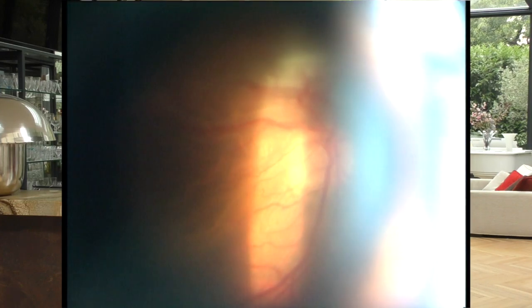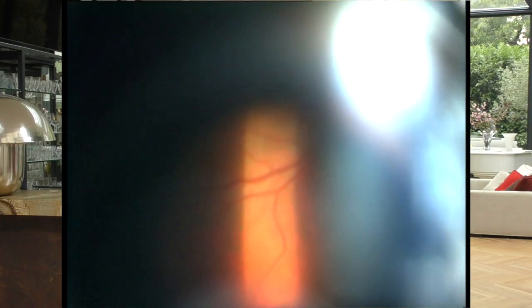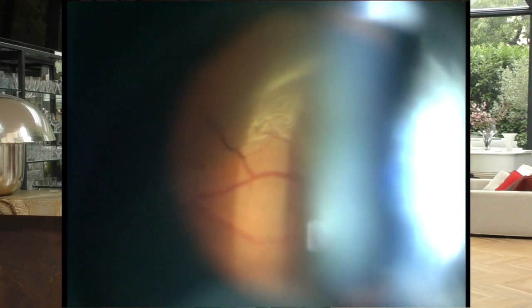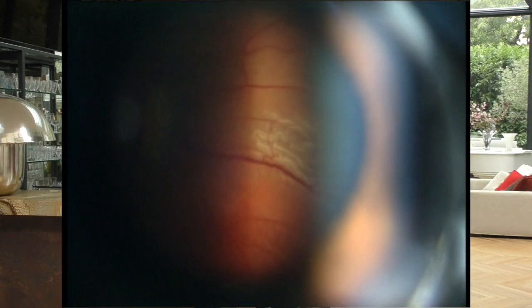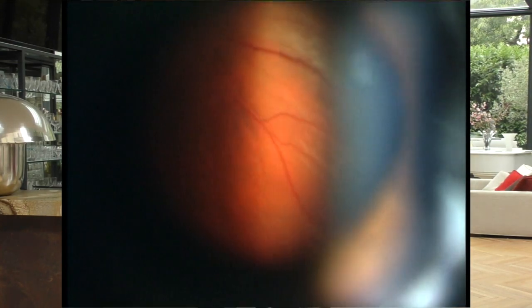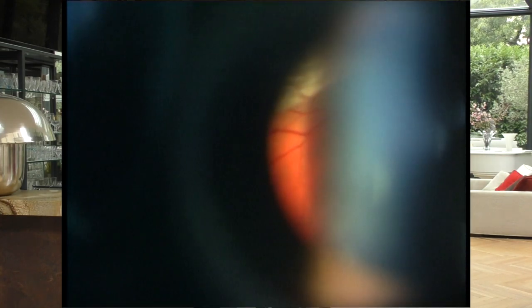I then used to systematically examine the posterior pole with a simple Volk lens without contact to look at the macula. Not so much to see if it was detached, because it never really influenced my strategy, but especially to see if a retraction syndrome could direct me toward vitrectomy. I was also afraid that at the end of the examination, all absorbed by the examination of the periphery, I would forget to look at the macula. I took advantage of this lens to make a small retroequatorial tour and establish the limits of the detachment that I noted on my drawing before placing my contact lens and looking at the periphery.